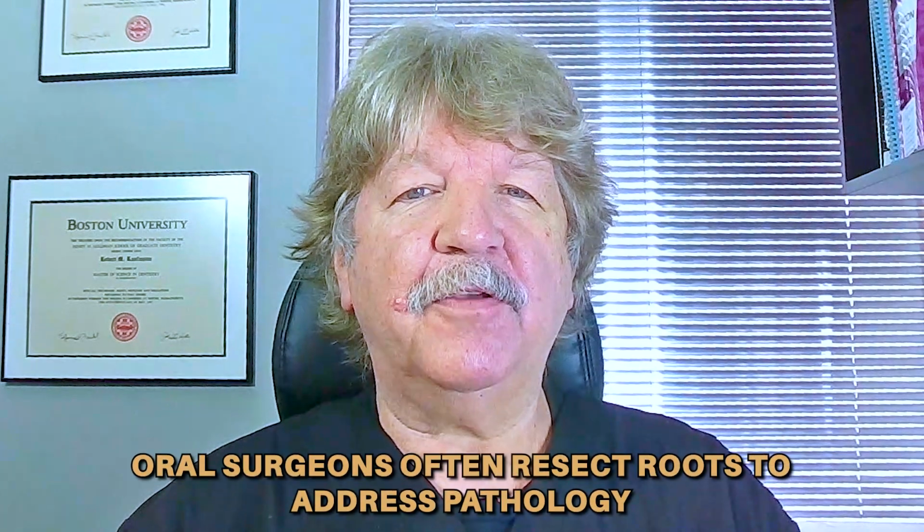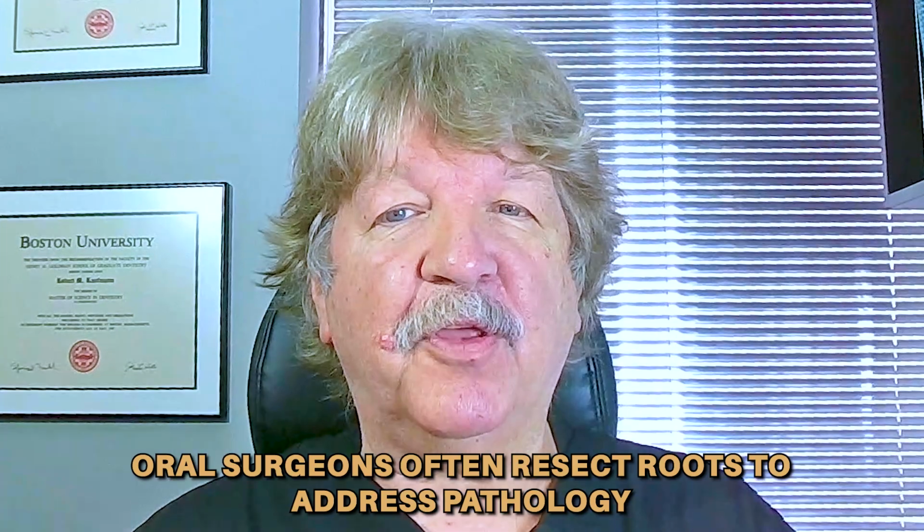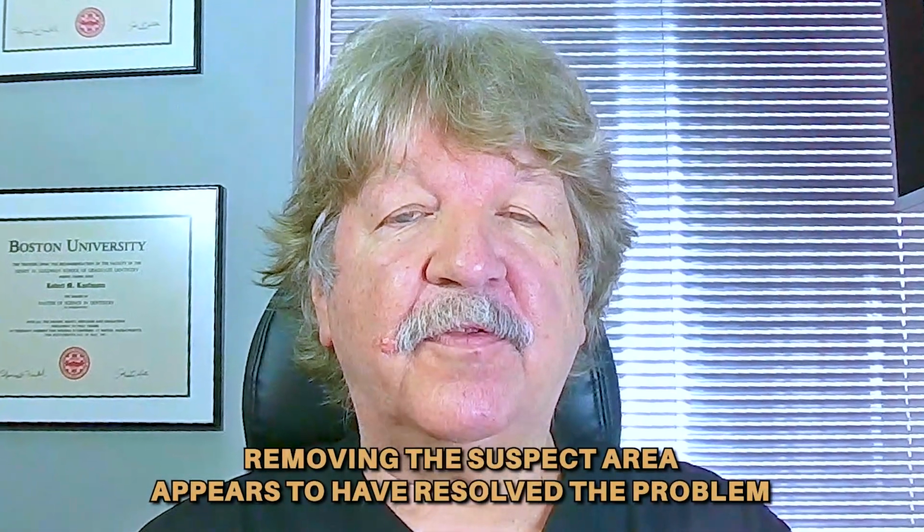I'm not sure why the initial surgical treatment failed, but I found the case to be extremely interesting. I've always wondered why our oral surgical colleagues can get away with simply resecting the roots of teeth in order to deal with pathology without any consideration of the canal or its contents. But here's an example of a case where just removing the suspect area seems to have solved the problem.